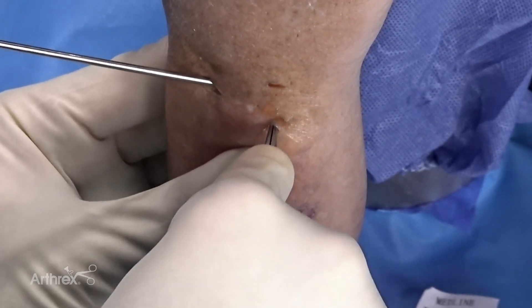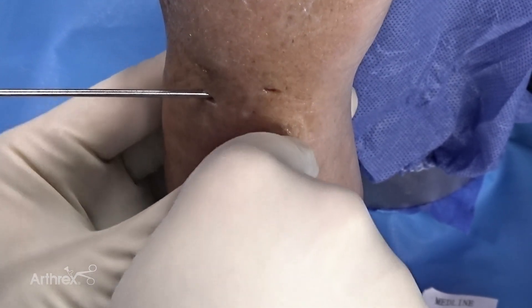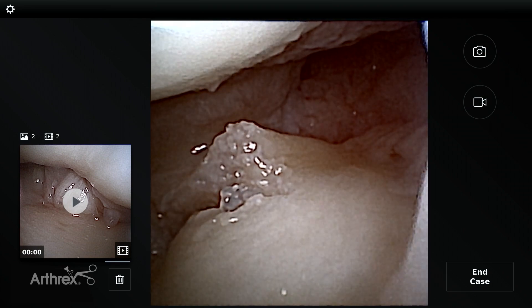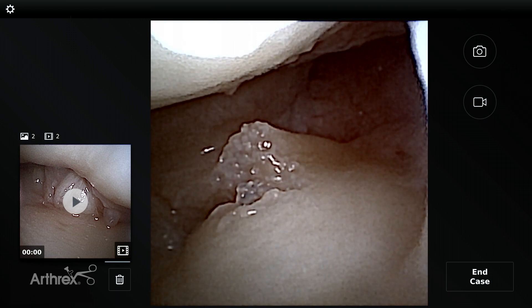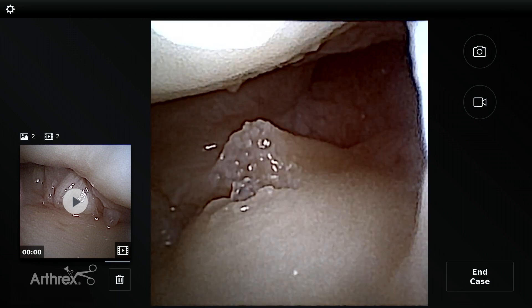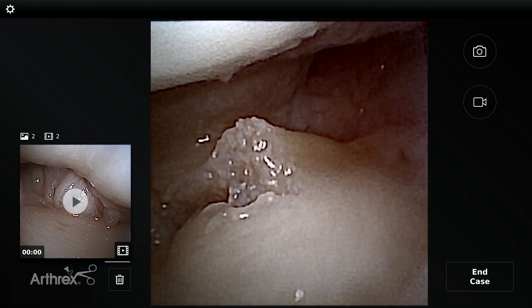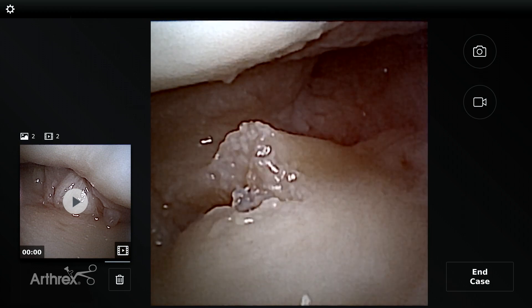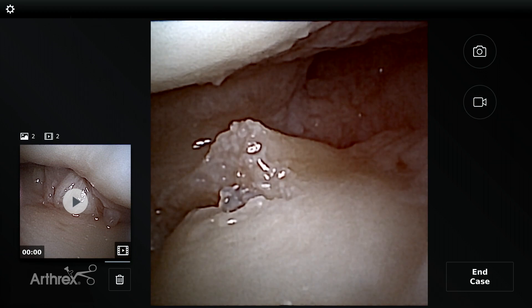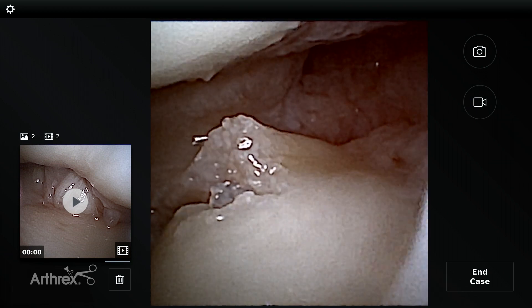I've removed the needle, made an incision where the DRUJ portal is going to be, and taken some tenotomy scissors or a curved mosquito clamp. I've come over the ulnar head — remember we want to avoid any iatrogenic injury to the cartilage. With the nanoscope still in the radiocarpal joint, I'm underneath the TFCC, so with confidence you can deduce that you're in the correct position. There's nothing more frustrating than going in blind, but under the nanoscope you can see exactly where you want to be.